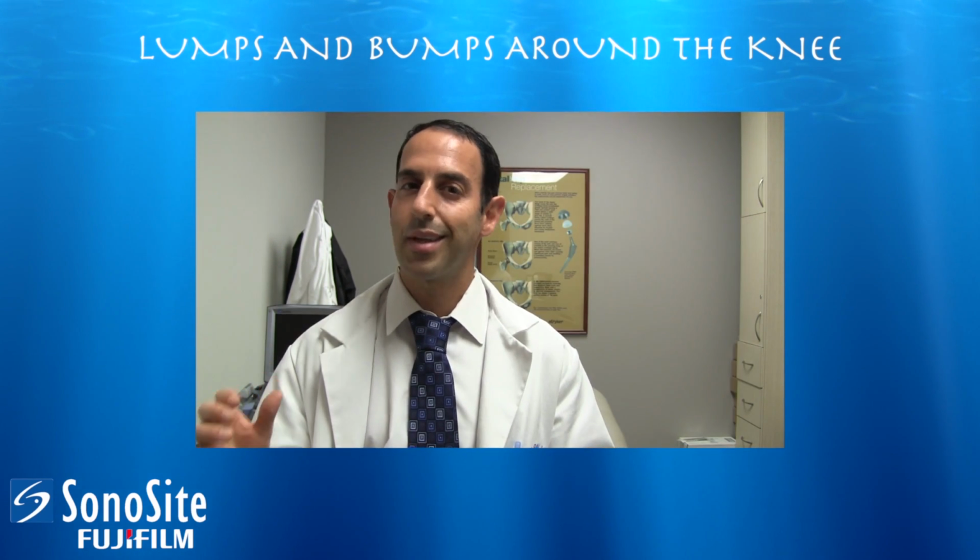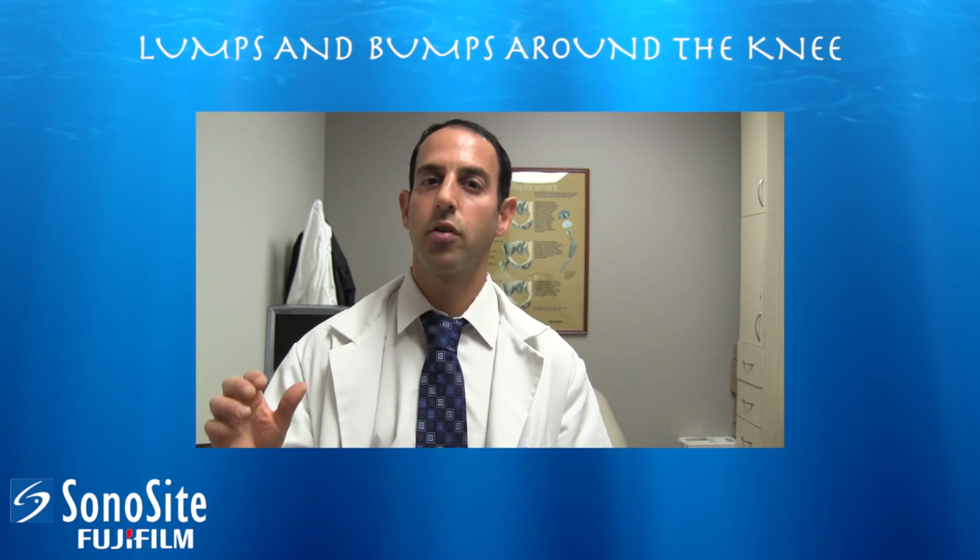If you see a cyst that's underneath the calf musculature, and certainly if it looks irregular with different types of echogenicity within it, then you actually worry about a soft tissue tumor or sarcoma, and certainly that is something that needs to be worked up with MRI imaging.